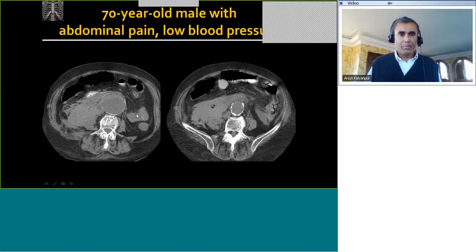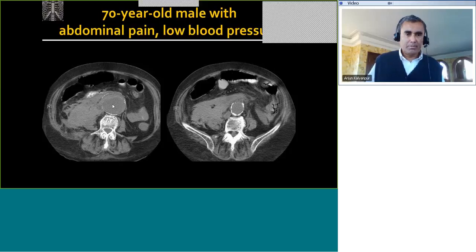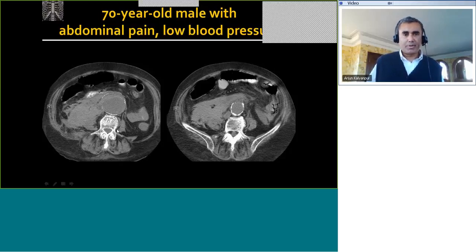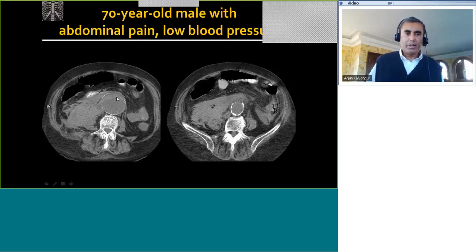The reason for mentioning the theme of this class is that most radiologists will pick up the large abdominal aortic aneurysm and certainly the large retroperitoneal hematoma and recognize that this is a rupture. The next stage — what makes a great radiologist — is being able to detect the hyperdense crescent in the wall, so that in a patient with an unruptured AAA one can guide the clinician to the significant risk of impending rupture.